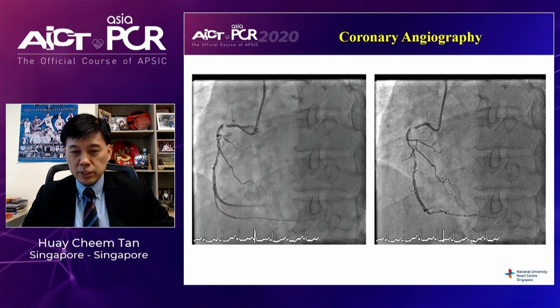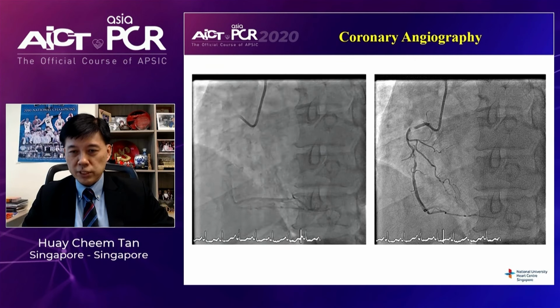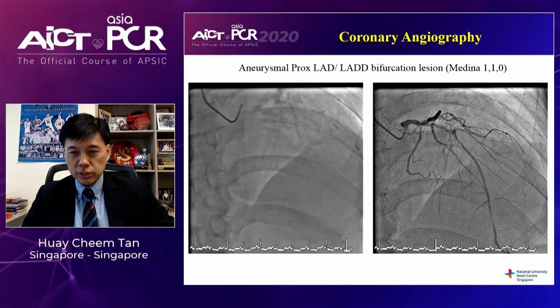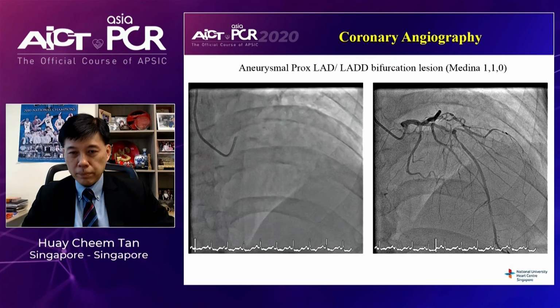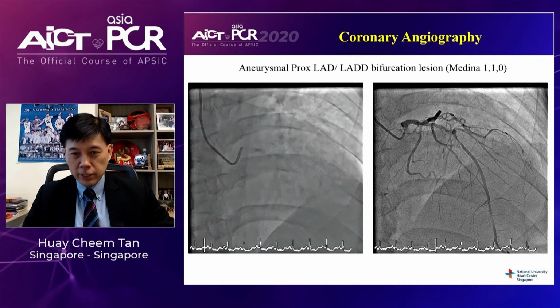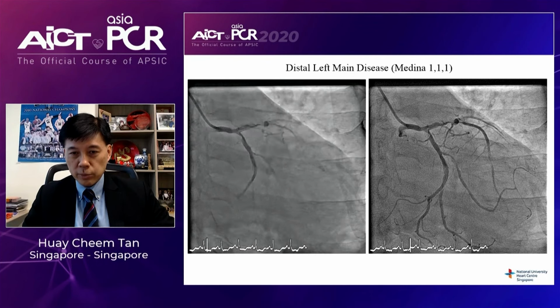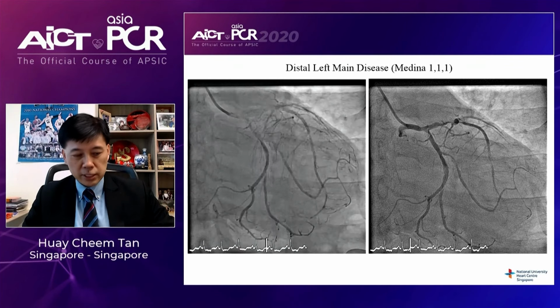When we start looking at the angiogram, this is a right coronary angiogram. You can see that there's a high-grade discrete proximal RCA stenosis, followed by a fairly diffuse segment in the proximal RCA as well. When we go to the left coronary artery, there is diffuse proximal and mid-LAD stenosis. What is of significance is that you can see a very calcified proximal LAD stenosis, which is followed by a post-stenotic aneurysm. And this is followed by a distal diffuse high-grade mid-LAD stenosis. On top of that, in the RAO caudal view, we can see that there is also distal left main disease involving the ostium of the LAD as well as the ostium of the circumflex artery. So indeed, left main and triple vessel disease is what we are dealing with.